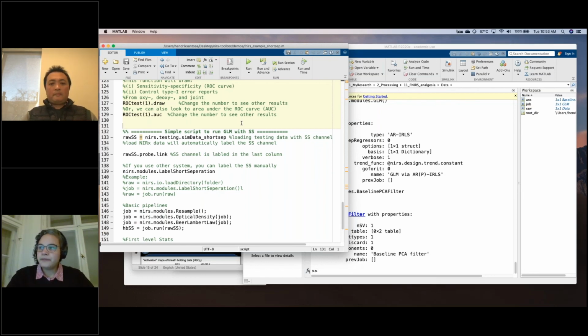Another interesting question: what happens if you lose the data in one of the short channels? Do you see this as a big issue? Do you mean losing, like not a number? Yes. I can try to answer that. In our case, if you use our bundles, you have 8 short separations. So if you lose the data in one of them, and since you showed that 5 short separations would already be good enough to get a nice prediction, losing one channel or another wouldn't be a big issue, right?